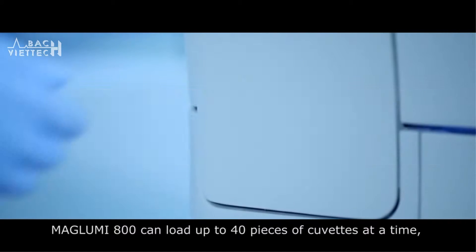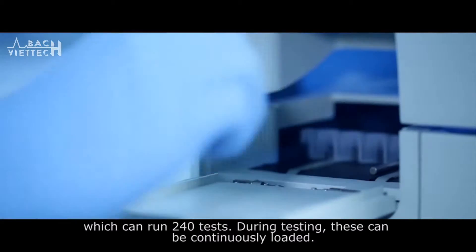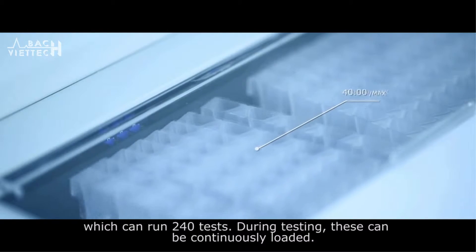The Maglooby 800 can load up to 40 cuvettes at a time, which can run 240 tests. During testing, these can be continuously loaded.